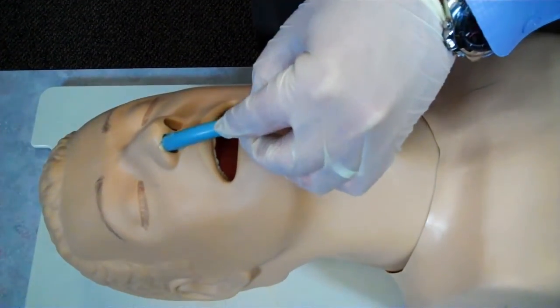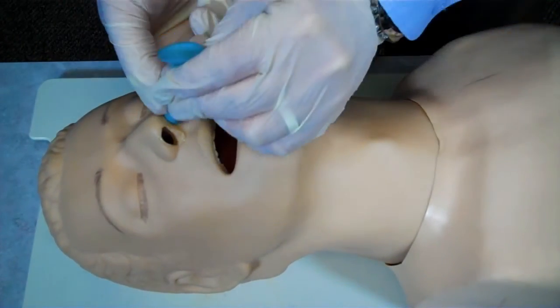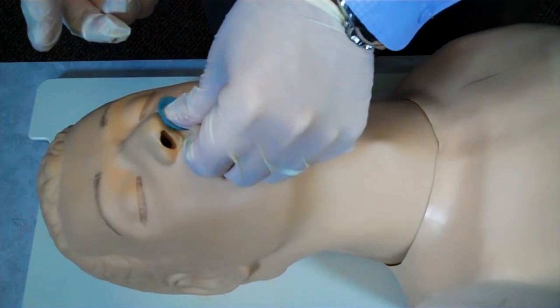If I meet any resistance inserting the airway, I will attempt to insert it in the other nare with the bevel toward the septum.